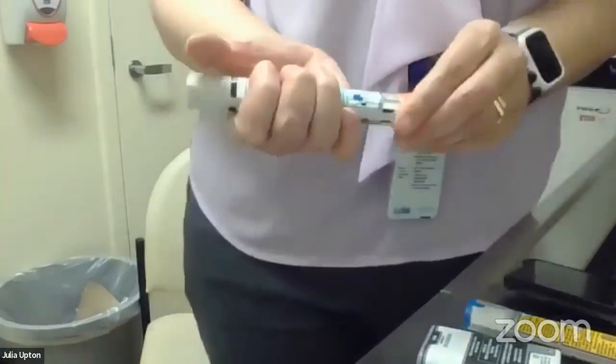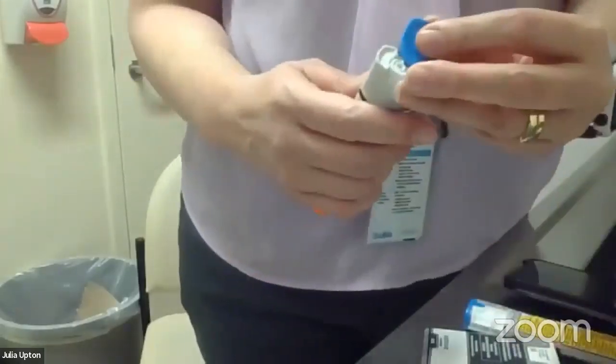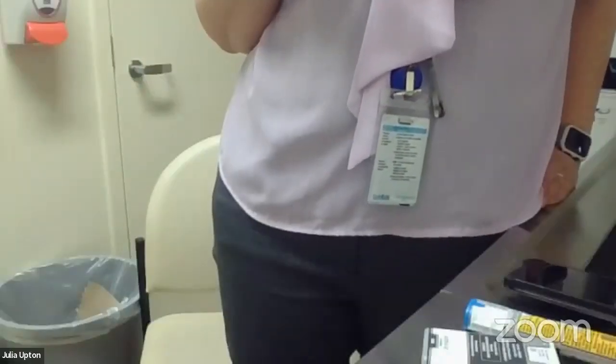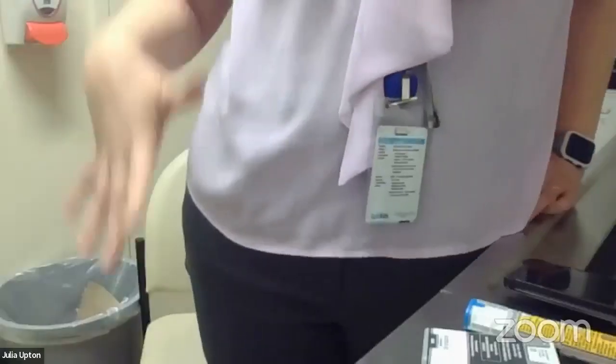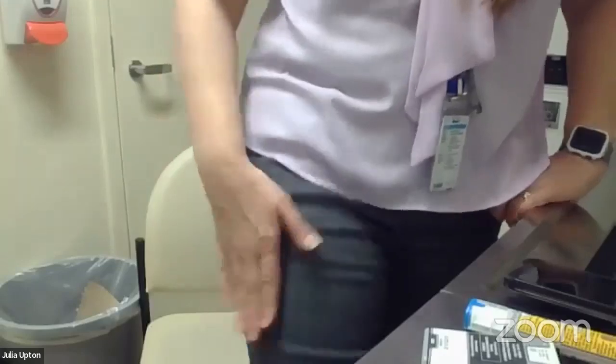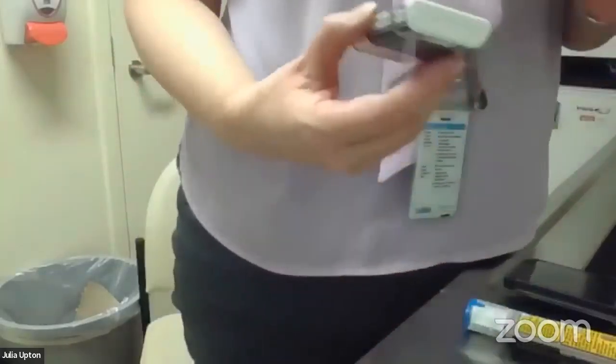Great. So that's that one. Just one quick note, although I know you're doing the demo, so it's hard to do sitting, but most people we'd recommend them sitting or lying down. Obviously, I'm not going to ask you to get on the floor and show it. So perfect. Yes, absolutely. So lying down is ideal. I am standing largely so you can just see the location. Thank you for highlighting that.